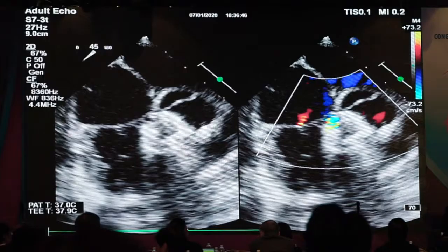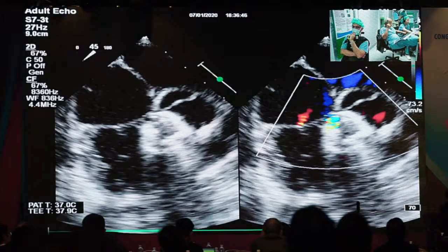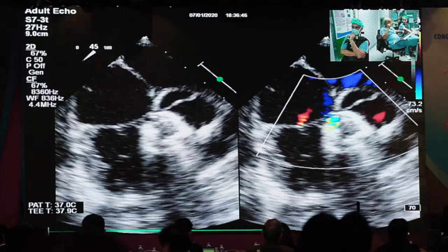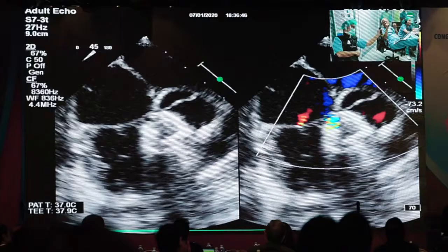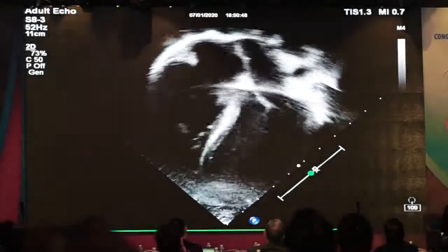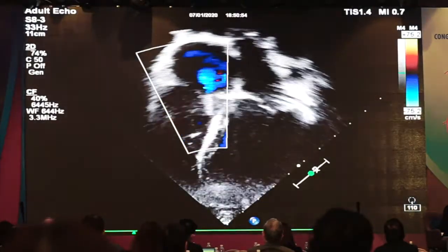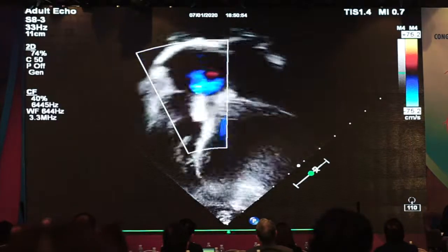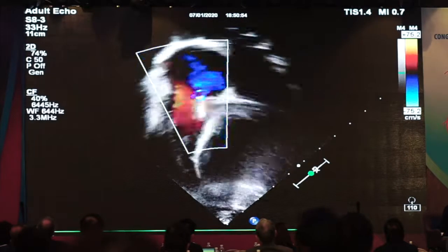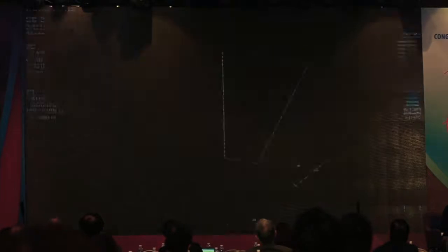Thank you, Chuck. So now you've heard the comments from Professor Qureshi. The choice is yours. What's your plan? So we plan to use the double disc device because the size of the VSD is not that small. We have many kinds of devices, but today we plan to use the MFO device from LifeTech company. Dr. Supar will show you the size of the device. We plan to use 10-8 for closing the defect.